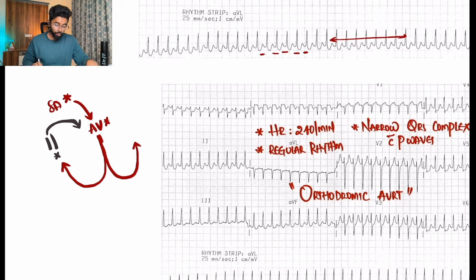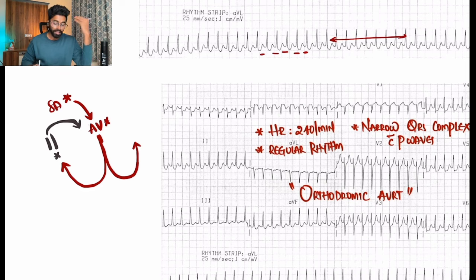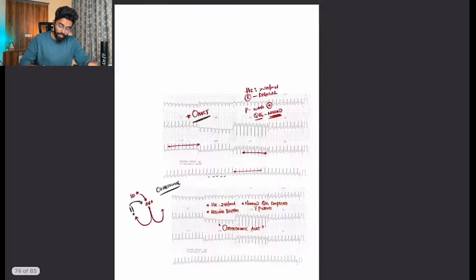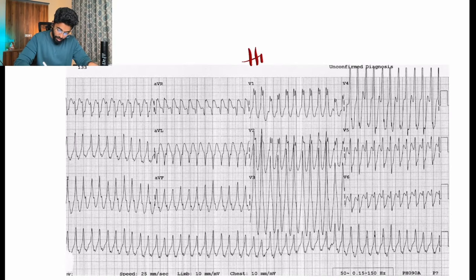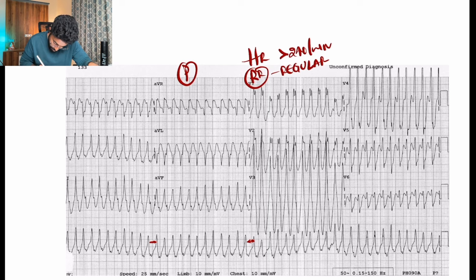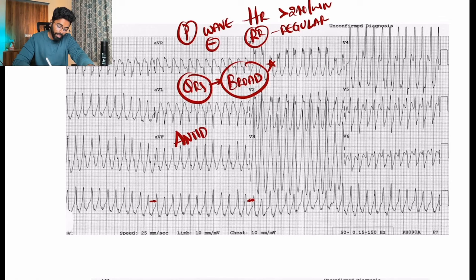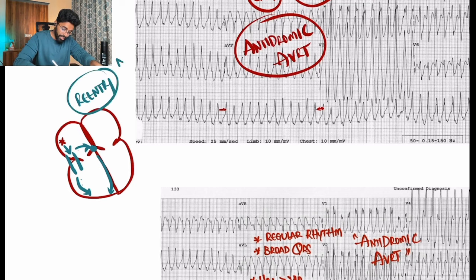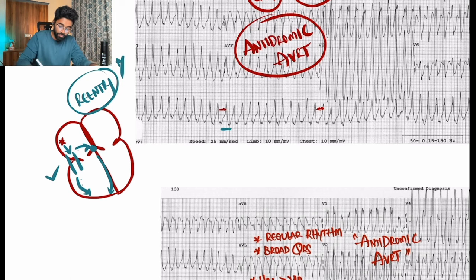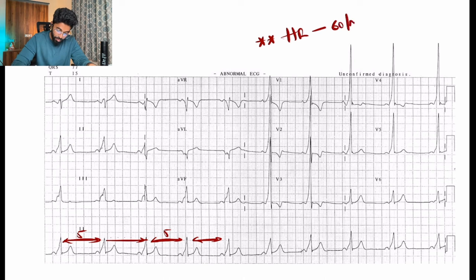If the SA node activates some other electrical pathway in the heart — not the AV node first — and the ventricles are activated by that accessory pathway, then the QRS will definitely be broad or prolonged. For the next ECG: heart rate more than 240, rhythm almost regular, P wave can be appreciated at points, and the QRS is broad. This is antidromic AVRT, where the re-entry circuit activates the accessory pathway early, then re-enters at the AV node level, producing tachycardia with broad QRS complexes.